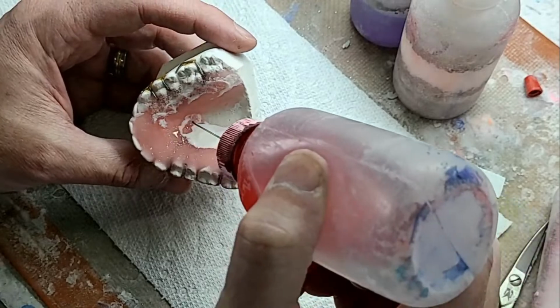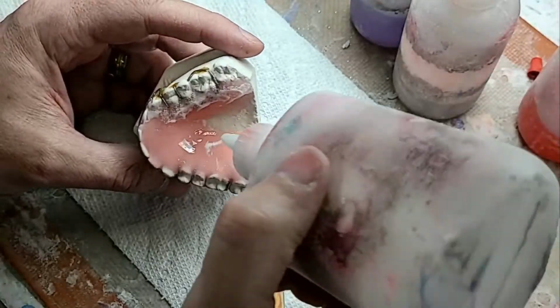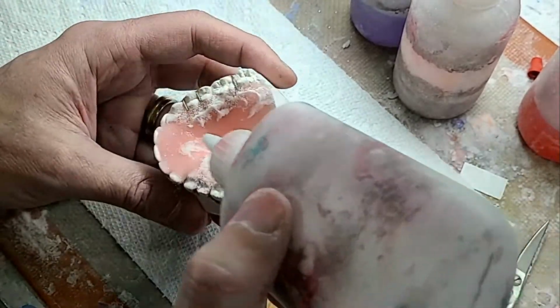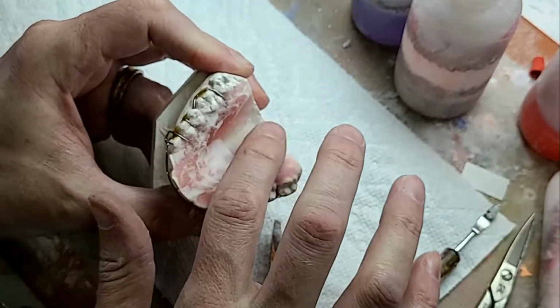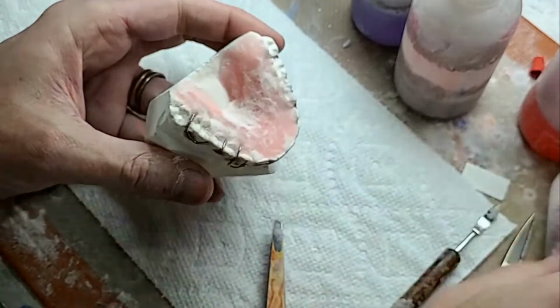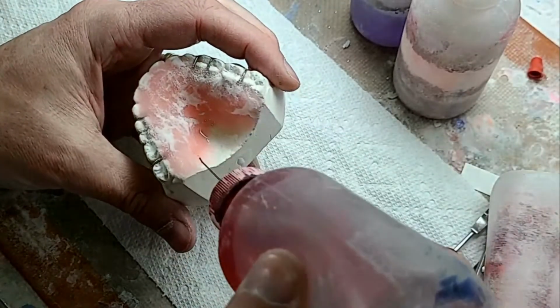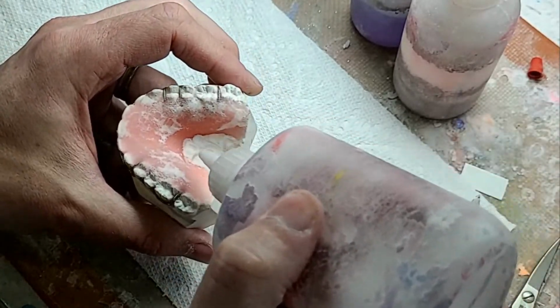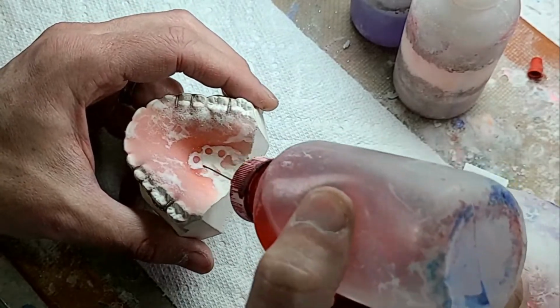But we do put them in a pressure pot, and the pressure pot is I think 120 Fahrenheit is where it's set. So I'm patting this with my finger. Use gloves if, you know, acrylic bothers you. So let's do the full palette part. I'm trying to make this as even as possible, thickness wise.